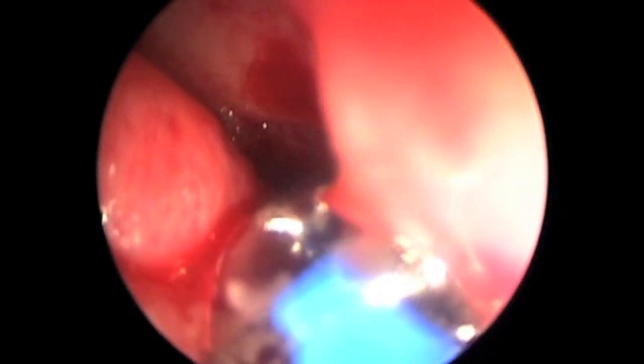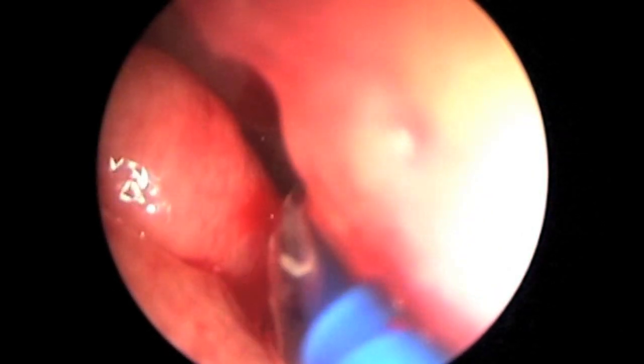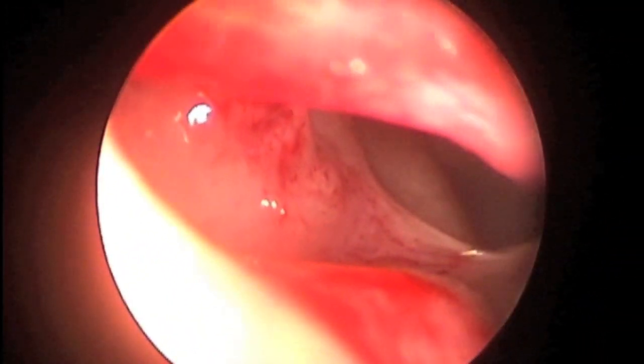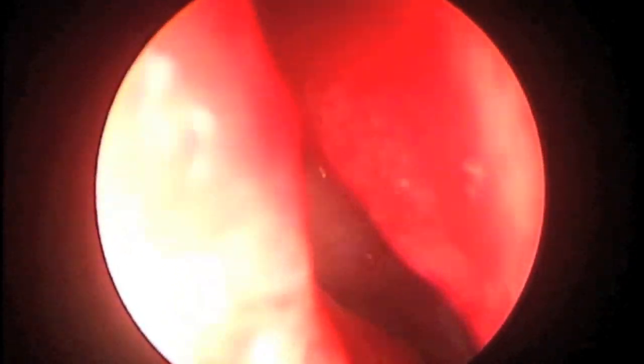The balloon is then slid over to the malleable tip and inflated. It is then deflated, removed, and inspected. Viewing in with an angled scope, we can see a nice maxillary middle meatal antrostomy.